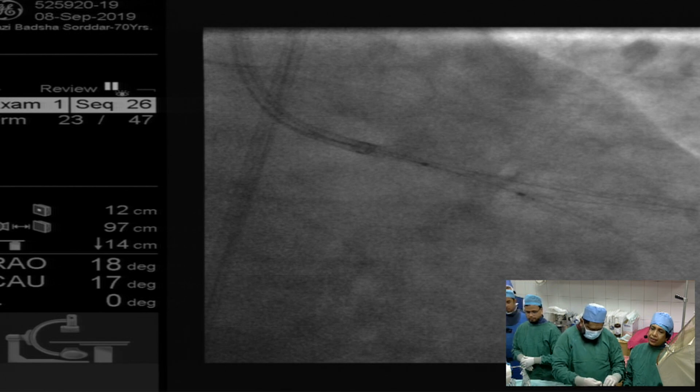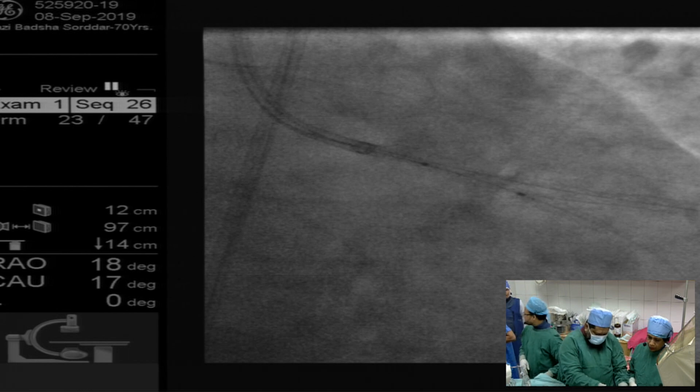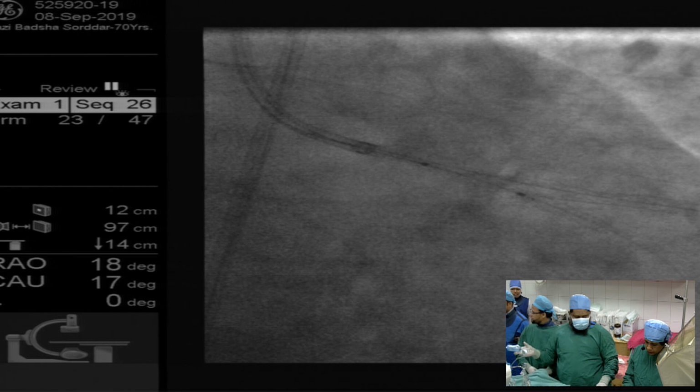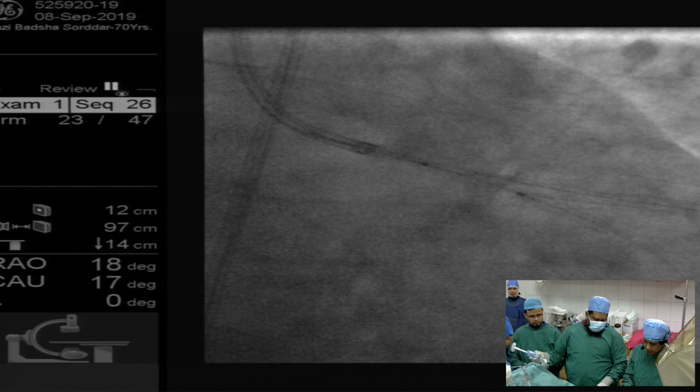And that's another thing, you need to remember which wire is going to which vessel. One easy way of doing that is to use different colors of wires and keep them separated by a napkin. That way there's less chance of twisting of the wires, which is really very good.